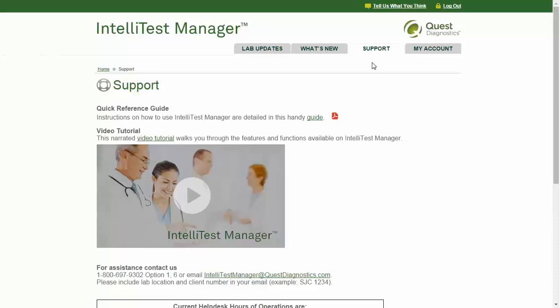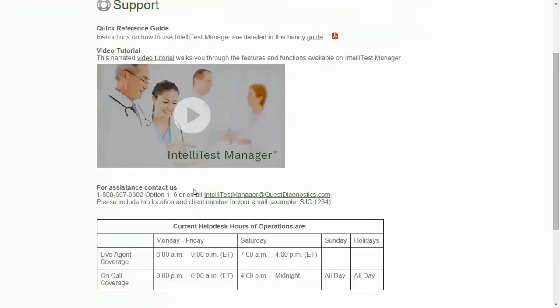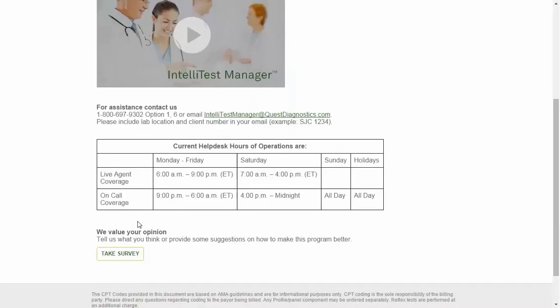The Support tab contains helpful instructions for using IntelliTest Manager. The Quick Reference Guide provides brief instructions in a PDF document. For more detailed information, you may replay all or part of this video tutorial by clicking here. This page also displays contact information if you would like to reach out for assistance by phone or email, and there is an option to provide feedback by completing a brief survey.